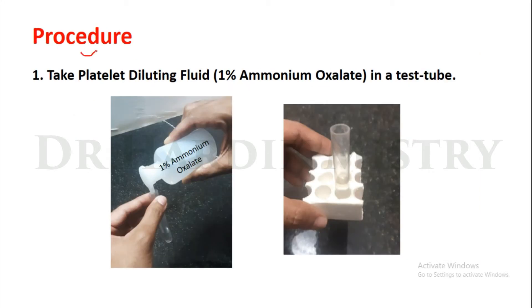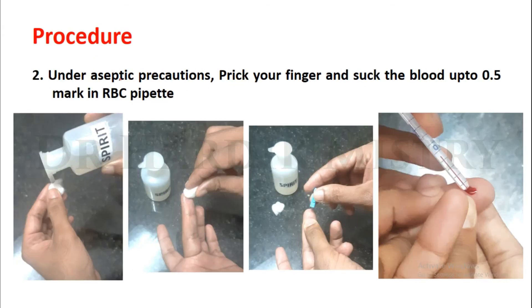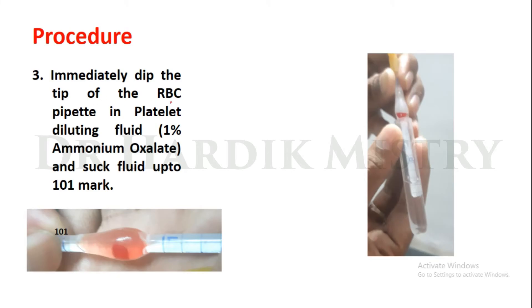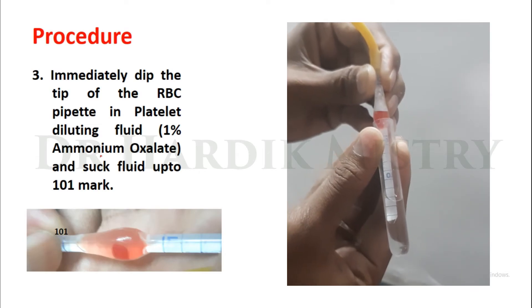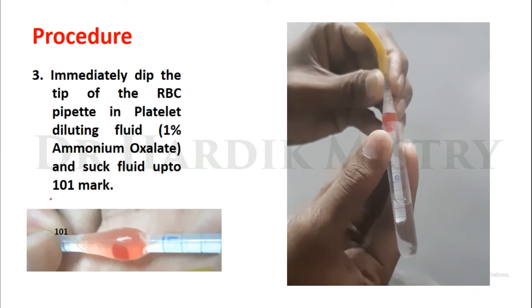Now we begin with the procedure. Take platelet diluting fluid — 1% ammonium oxalate — in a test tube. Under aseptic precautions, prick your finger and suck the blood up to the 0.5 mark in the RBC pipette. Immediately dip the tip of the RBC pipette in platelet diluting fluid and suck fluid up to the 101 mark.